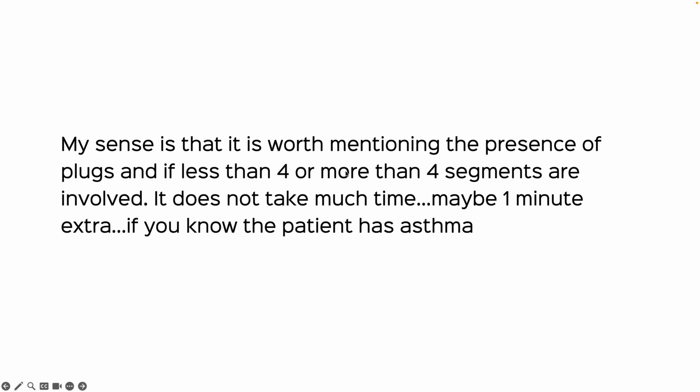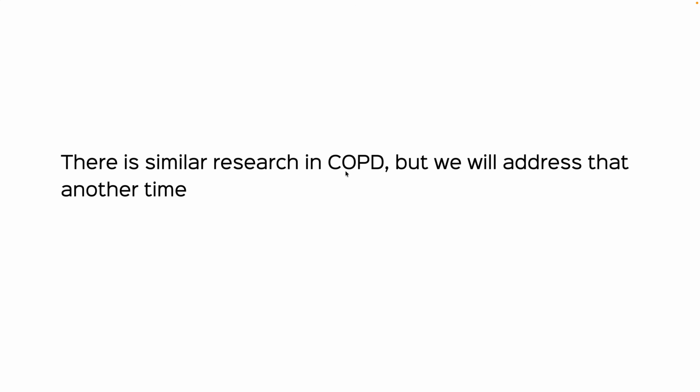So again, if you know that the patient has asthma and you're looking at a CT of the patient, take a minute to look for mucus plugs and say yes or no, and if yes, maybe more than 4 or less than 4. There is similar research in COPD. I came across that while I was looking for references, but that's even more muddy, so we will address that another time if and when there is more data or a new paper.